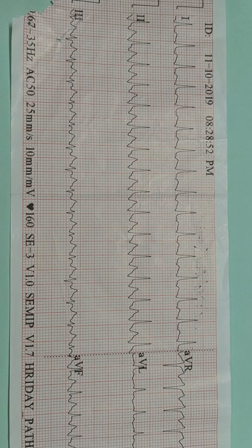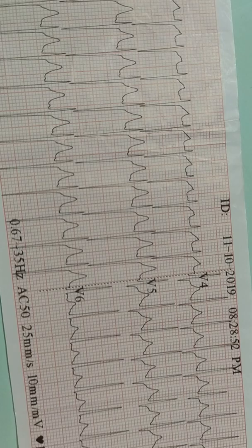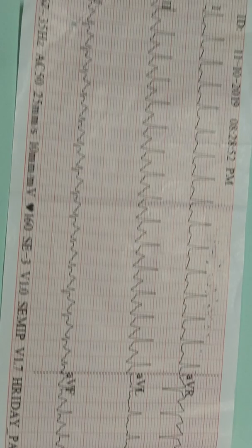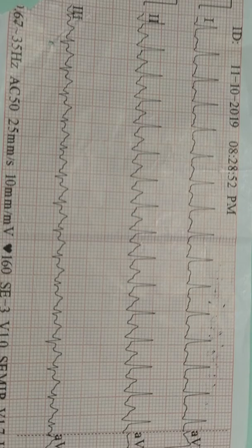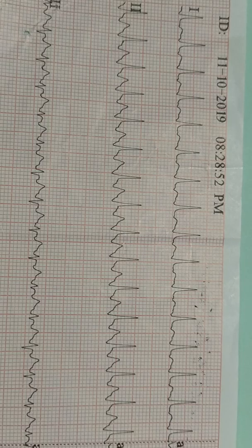This is an ECG showing tachycardia. Look at it — the heart rate is increased, so it is tachycardia. Now, is the tachycardia regular or irregular? Look very carefully in lead II at the RR interval. It is regular, so it is a regular tachycardia.